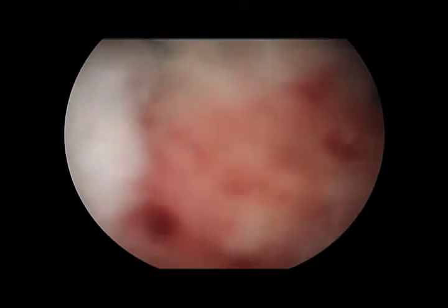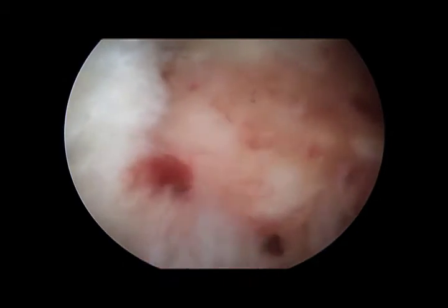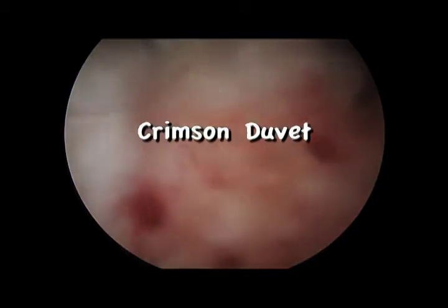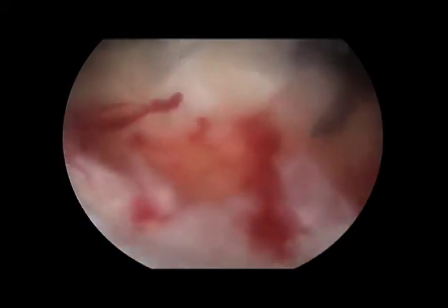As we turn down our pump and open the drain, we can observe the marrow elements egress from the bone marrow vents, producing the so-called crimson duvet. This concludes our case of the month.